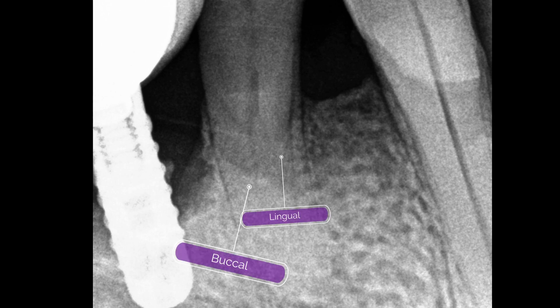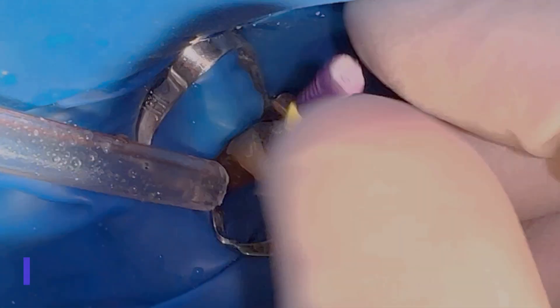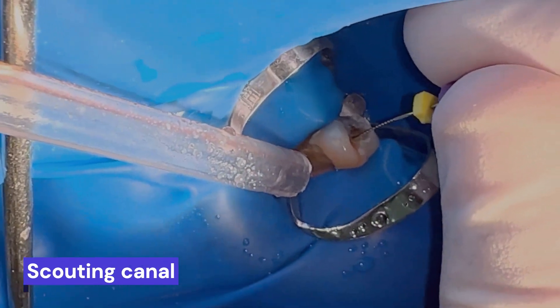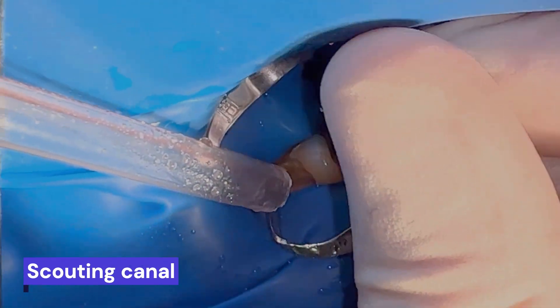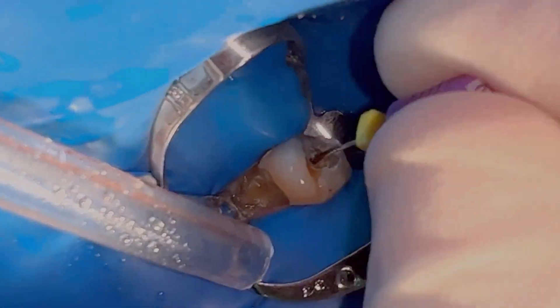To achieve a straighter access to the lingual canal, we can use ultrasonic tips with movements towards the lingual. The first canal encountered is the buccal. Later, with a pre-curved file introduced into the canal looking towards the lingual, we try to penetrate the lingual canal.